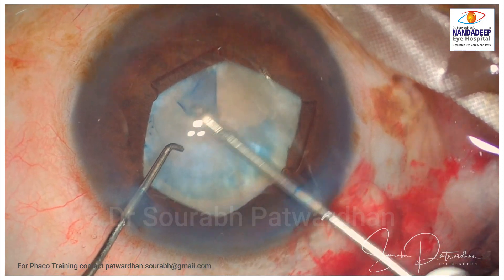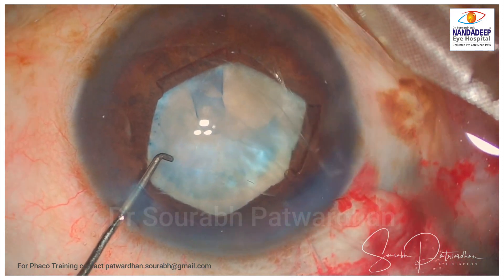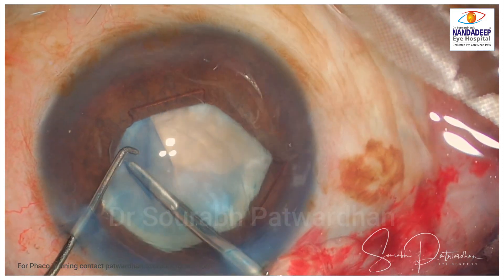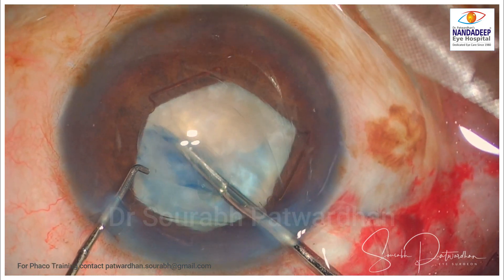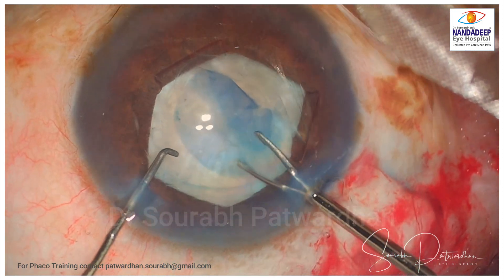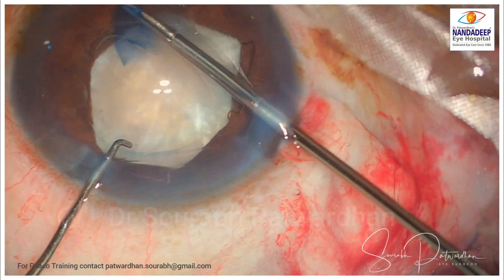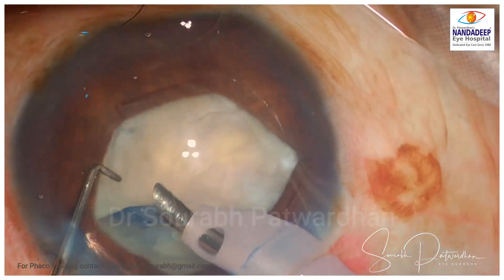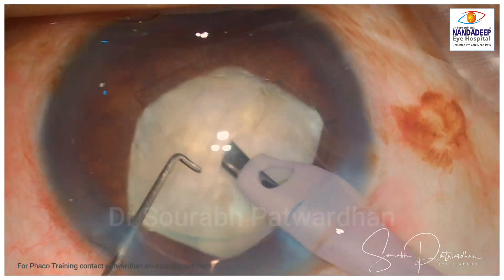Now here what happened is that there is some fibrous area of the anterior capsule, so I shifted to microcapsulorrhexis forceps. With microcapsulorrhexis forceps I could do the CCC very easily. Beginners can use iris hooks — it will give much better visibility of the anterior capsule, which will help in doing the capsulorrhexis.